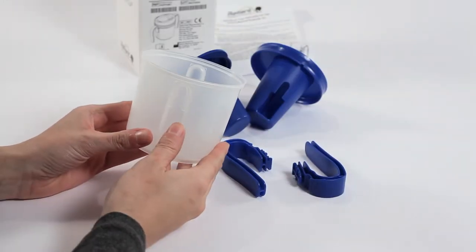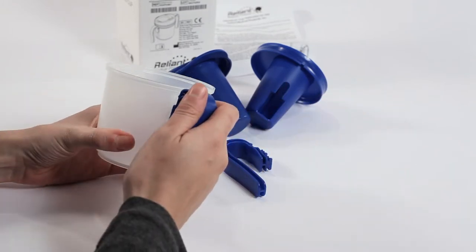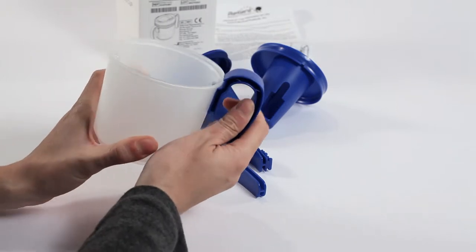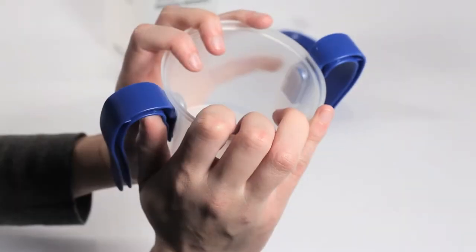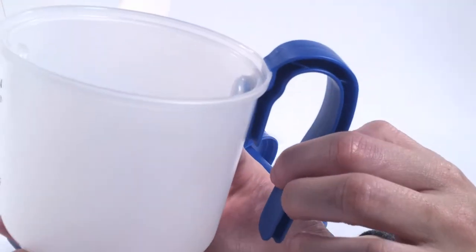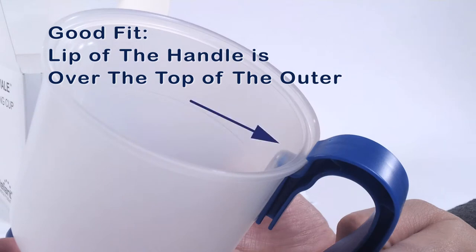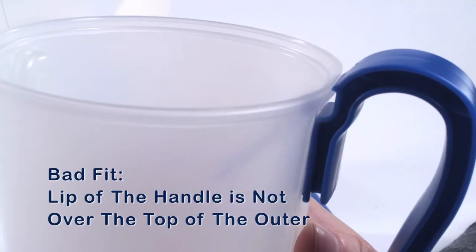The ProVail Cup can be used with one or two easy grip handles. To attach a handle, slide the base of the handle up through the slot along the side of the outer cup until the handle snaps into place at the top of the outer cup. When assembled correctly, an audible snap should be heard. Make a visual check to ensure the lip of the handle is over the rim of the outer cup and the handle is secure. If the handle is not assembled correctly, it could detach and cause spilling and possible injury to the user.